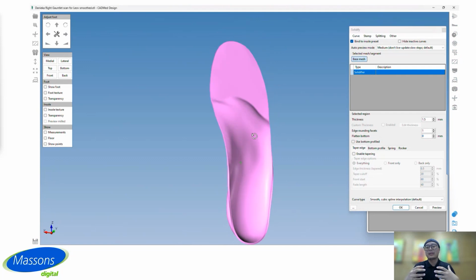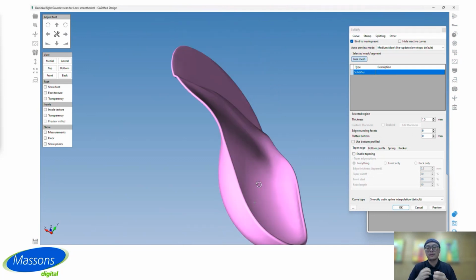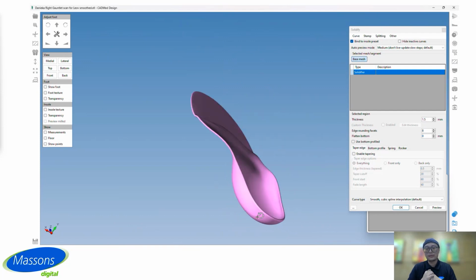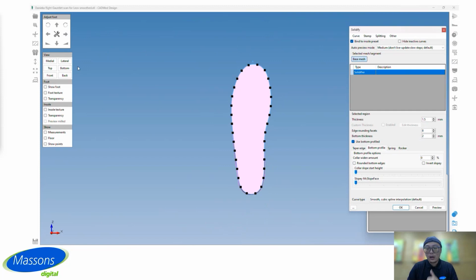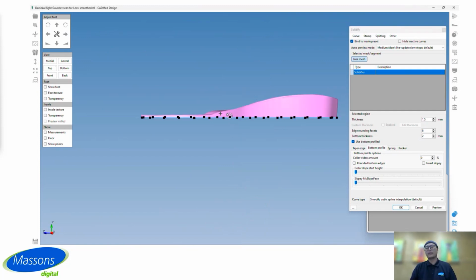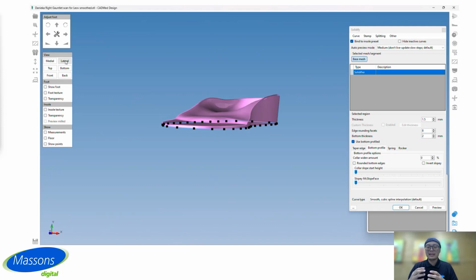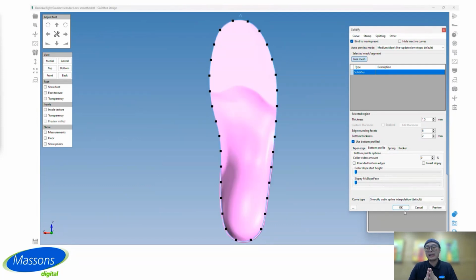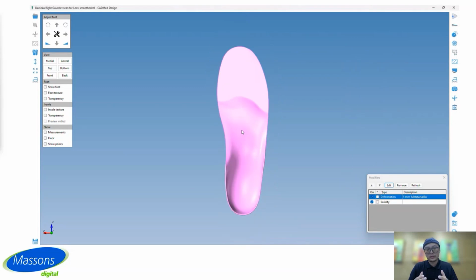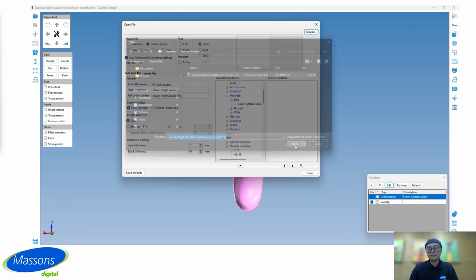After making all the necessary deformations, you can click the solidify button to convert your insole into a model ready for 3D printing. You can adjust the trimline or add the bottom surface for that. So this is only the basic insole design process, but CADMed has many more features to explore. If you are interested, I can provide a more detailed introduction in our future design webinar.